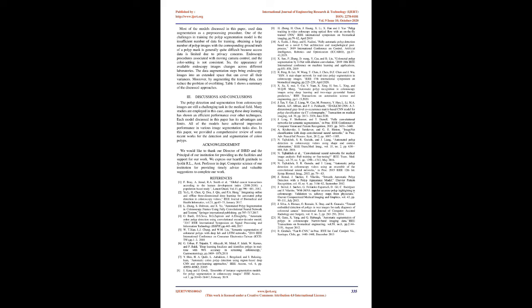A multi-channel CNN model is used to perform the classification of polyps using GLCM feature images. The CNN model used in this method consists of 7 layers that are 3 convolutional layers, 2 max pooling layers, and 2 fully connected layers. In each convolution layer, batch normalization and activation functions are performed. The model uses ReLU as the activation function, the cross entropy loss is the training loss, and a softmax function is used at the last fully connected layer. The proposed GLCM method can enrich the information of the small polyp without bringing in any artificial information. The proposed GLCM feature-based model can naturally overcome the problem of the various lesion sizes existing in all the CNN-based models, which may shift the current CNN raw image paradigm to a CNN texture image, GLCM, paradigm. The workflow of the 3D GLCM CNN model is shown in Fig. 10.